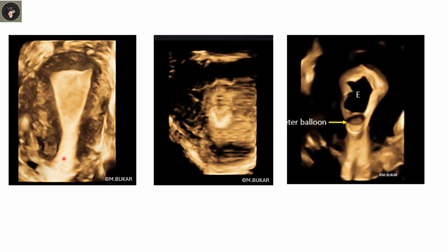So here is normal endometrium. See this? See part of the corner here. So now compare with this case of intrauterine synechia. Better still, if you have the facility for 3D, you can also do saline infusion sonography and look at these normal endometrial folds, the balloon catheter here.